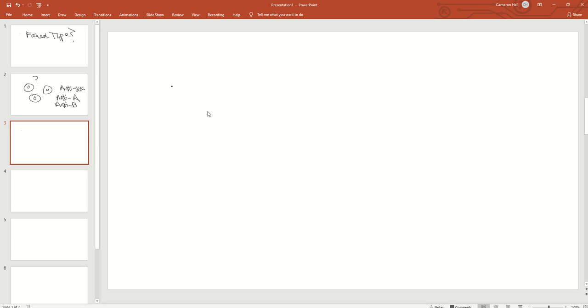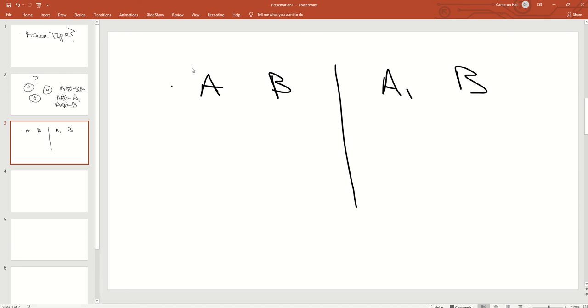But generally, they'll draw the diagram like this. So the beginning will be the forward type. It'll be like A, B, D for Rh, but we're going to ignore that for now. We'll go into Rh separately. So this will be your forward type, and then you'll have A1, B. And we're just going to draw it out like this. And we're going to put an F here for forward and R here for reverse.